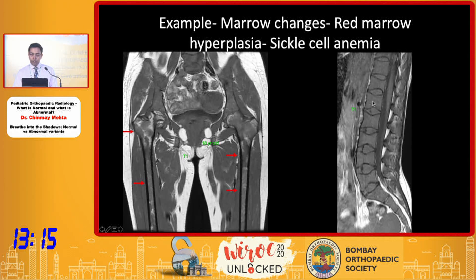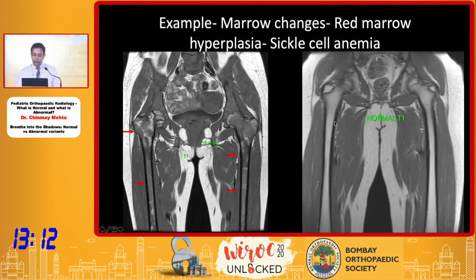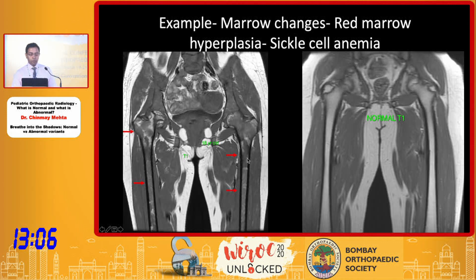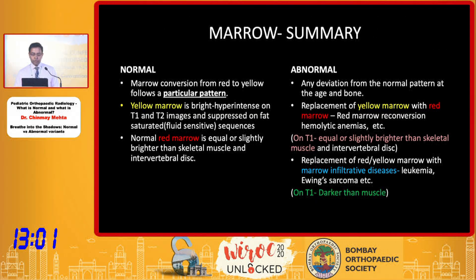On the spine images, this red marrow is equal to the disc signal, and that is why we call this red marrow replacement. This is how a normal 15- to 18-year-old MRI should look, and this is the T1 of our patient. So this is an example of red marrow hyperplasia in hemolytic anemias.